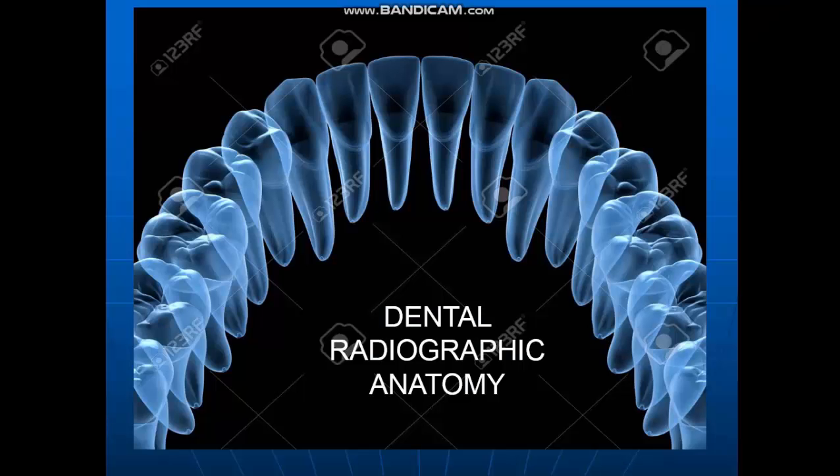So we have talked about dental diagnostic imaging and are already aware that these methods are specific. Each of them has its own application field. It's important to note that first, physical clinical examination should be conducted on the patient, and then dental radiological methods should be chosen.